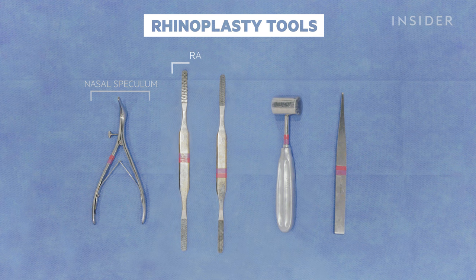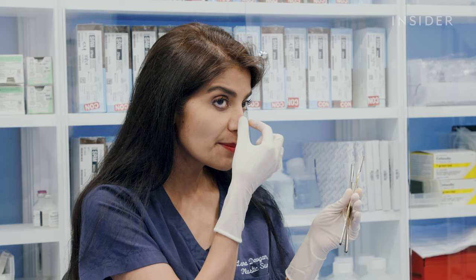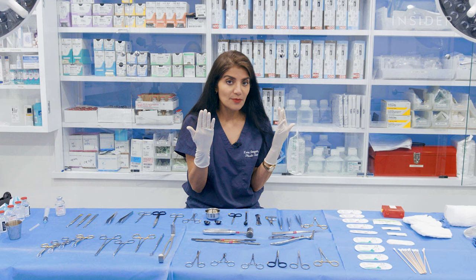And one of the ways that we address bumps is with rasps. And these are kind of like the equivalent of surgical nail files. The ridges on the rasps are actually coated with diamond dust. So they're extremely sharp and they're capable of filing down bony and cartilaginous humps on the side walls of the nose to make them narrower and the dorsum of the nose to make the prominence right here a little bit more refined.